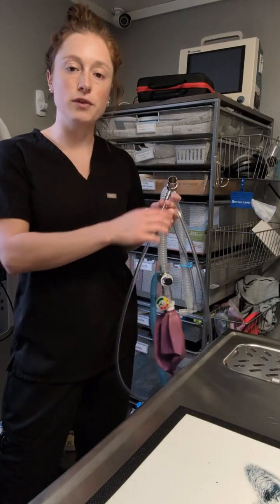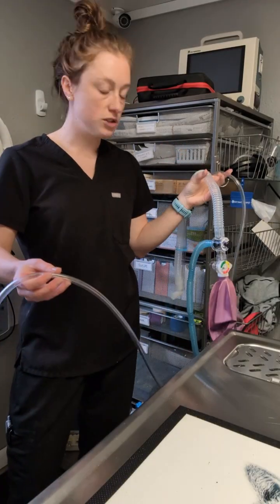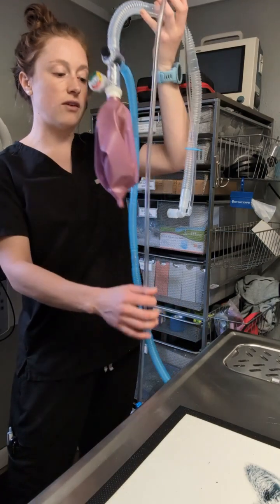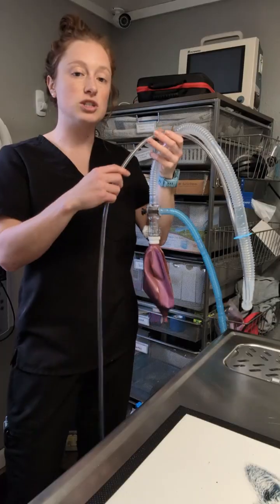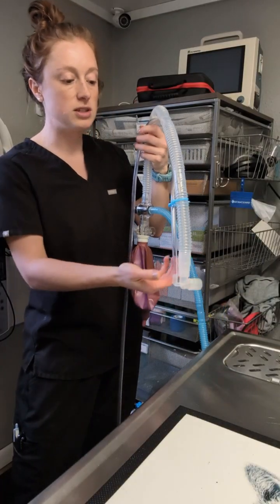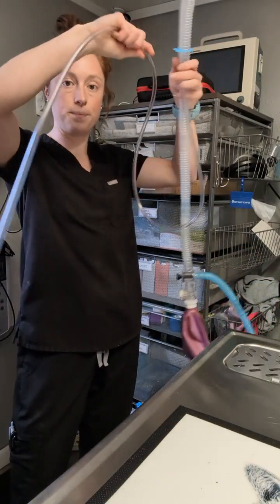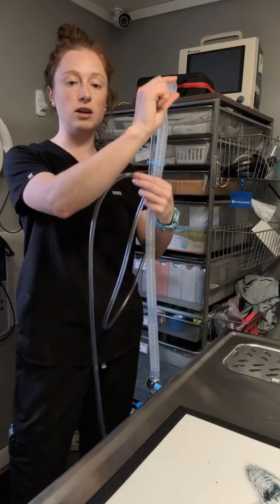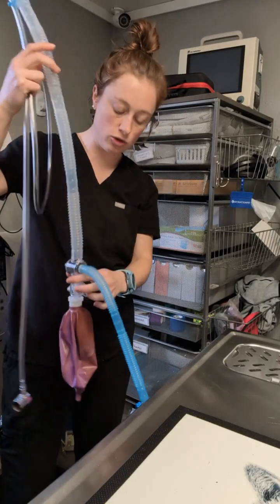We also have the option of using a non-rebreathing system for our small patients. Patients that are under 7 kilograms, we want to do this. This doesn't have any unidirectional valves or a CO2 absorber, which just keeps pressure down for the smaller patients, but it has similar components. We have our breathing tube, and the air will come in here, it will go to the patient, and then the patient will breathe out through this tube.